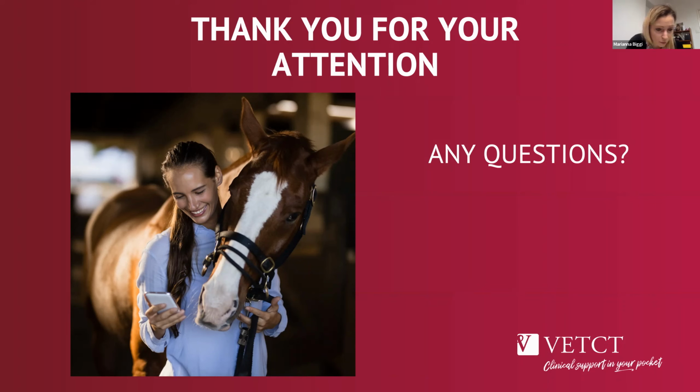Another question I have: do you find scintigraphy to be useful? My straightforward answer is no. You can diagnose dental disease using scintigraphy, but I consider scintigraphy is not much cheaper than CT. I would not recommend that as my first line of advanced imaging. Same way as I would not recommend MRI, because I think dental changes are much more difficult to diagnose using MRI than they are using CT. But of course, that depends what you have available. If that's the only technique you have available, then you can try and use it.